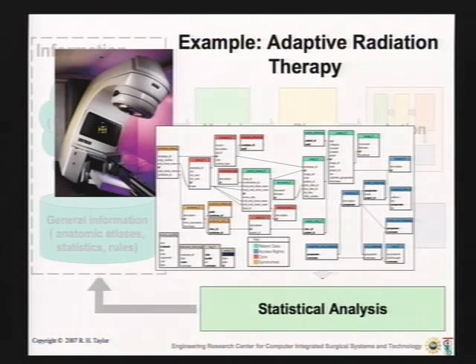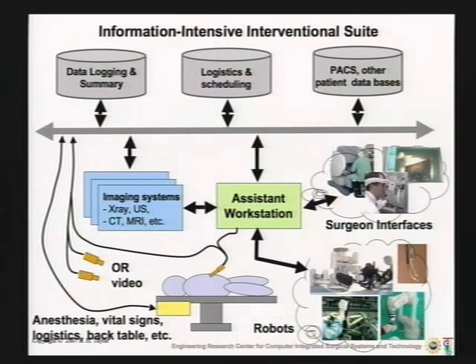And the basic goal is you'd like to be able to say, of all the patients in this database, here are the 25 who look most like this patient. In rank order, here are the complications. And by the way, here's the best treatment plan that we found so far. And we're going to use that as our initialization for a custom treatment plan for that patient. And I'm about to talk myself out of time, so I really can't go further. But this is something that I'm extremely excited by. And we're working with both radiation oncology and another CS faculty member, Misha Kasdan, on it.